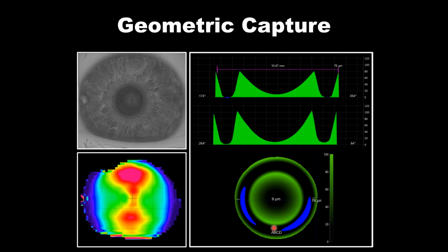The ortho-Ks tend to be a little more sensitive because you're trying to build a lens with 10 microns of apical clearance, 7 microns of apical clearance. It's ultra close to the eye. So we have to get this depth correct. But in a conventional corneal GP, a single vision or multifocal, we're looking for more like 20 microns in the center. So we have a little more room for margin of error.